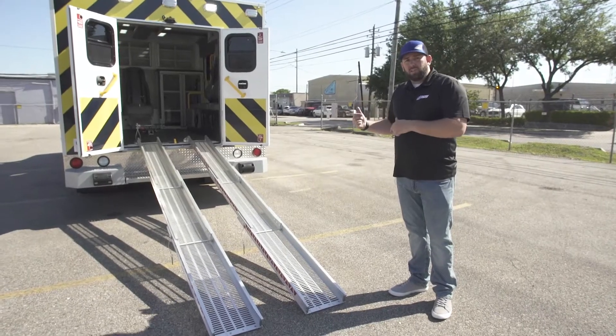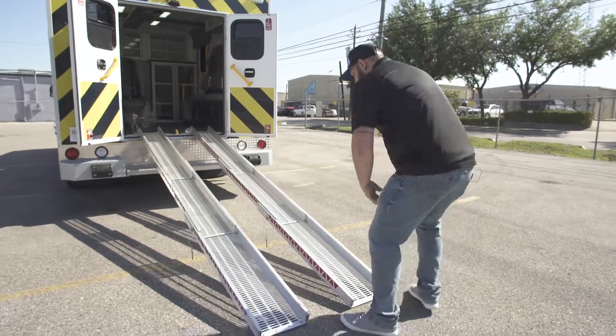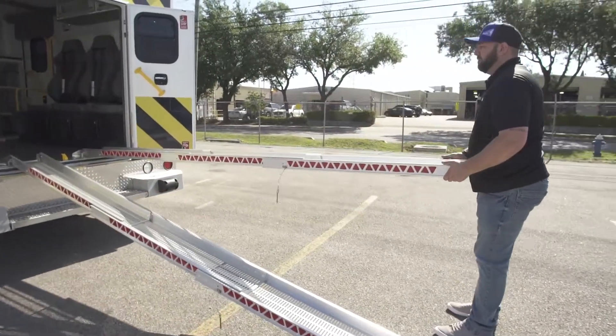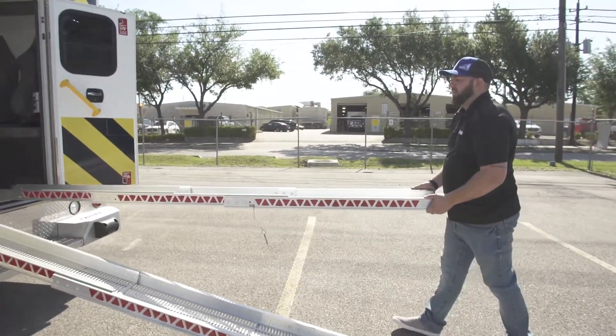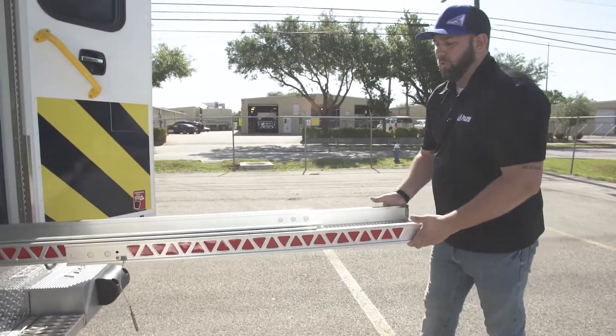To remove the ramps and put them back into storage is a very simple process — just reverse it. These are lightweight, but you pick them up, walk them into place, and be mindful: they telescope in, so watch out for pinch points.